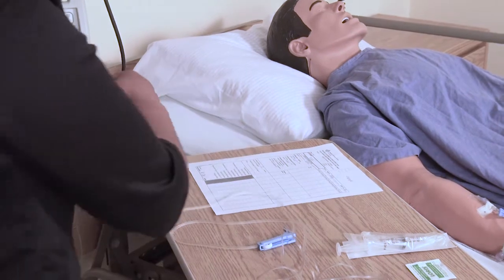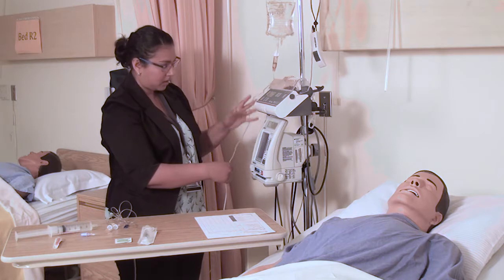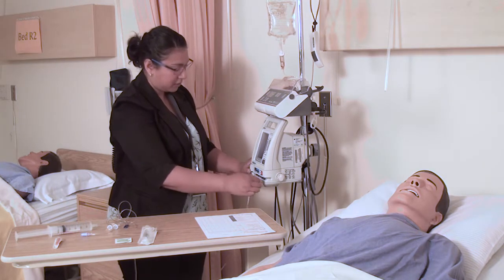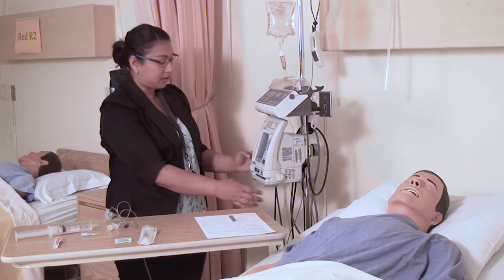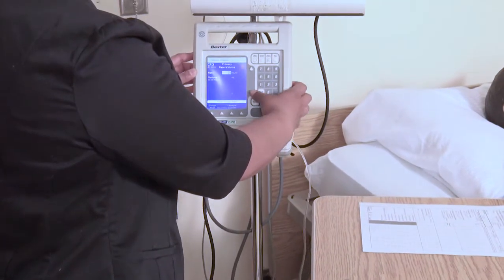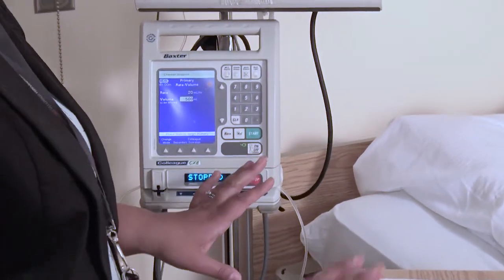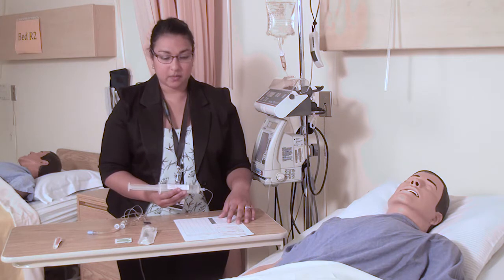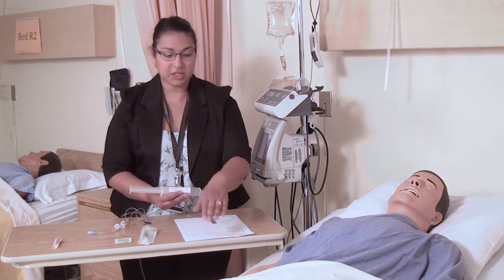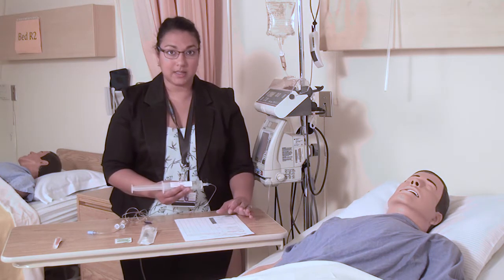I'm first going to load my carrier into the pump. I'm just going to set this at a TKO, so anywhere between 15 to 20 is my rate, and 500. I'm just going to confirm it, and I'm going to wait until everything else is done before I continue. I would also want to do my medication rights, my 10 rights. So I have my MAR here, my medication, and the patient's ID band. I would do my 10 medication rights at this time.